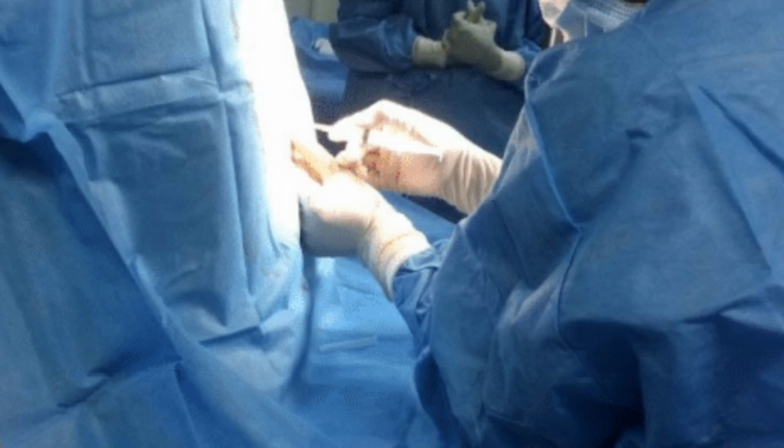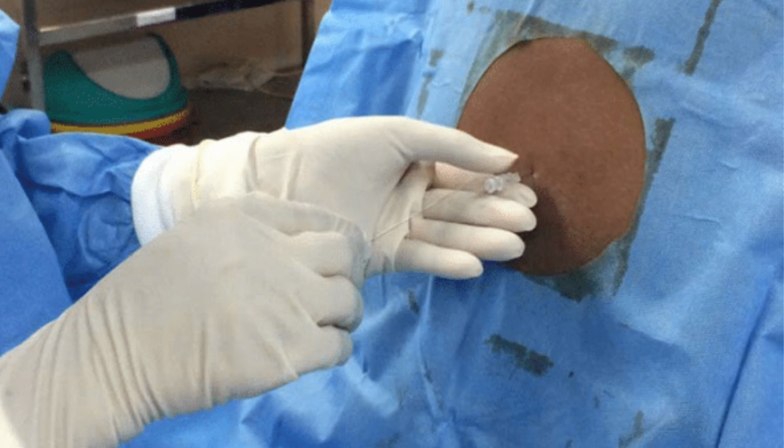That means anesthesia. According to the patient's condition, they are giving spinal anesthesia or general anesthesia. Mostly they are giving spinal anesthesia. Once the spinal anesthesia is given, we are starting the procedure.